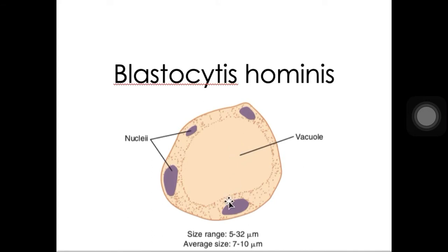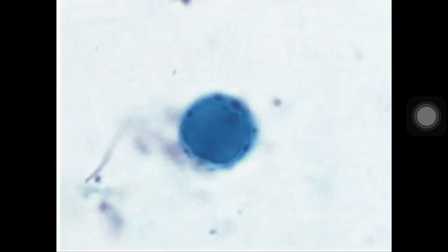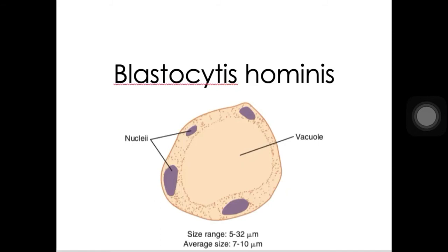And then, if we stain this one using iodine mount, then this one will be stained brown. But using a trichrome stain, this one will be stained dark green. As what you can see here, this one is a trichrome stain, so green color siya dito. Bluish or bluish green din siya pwede. Again, that's for your Blastocystis hominis.